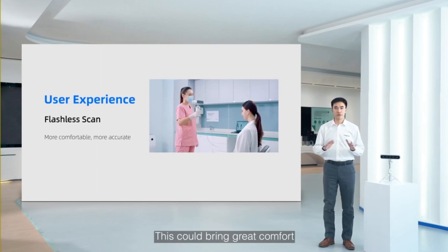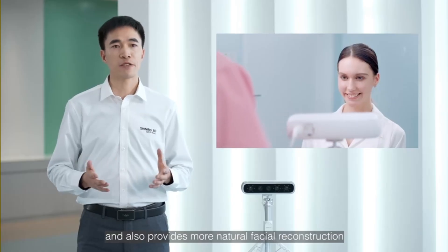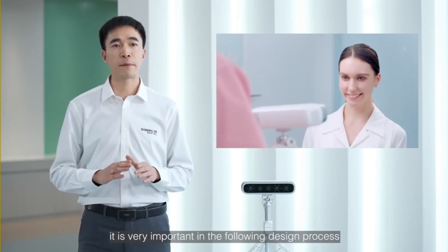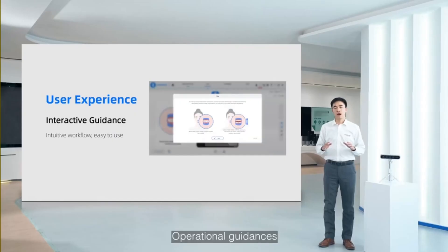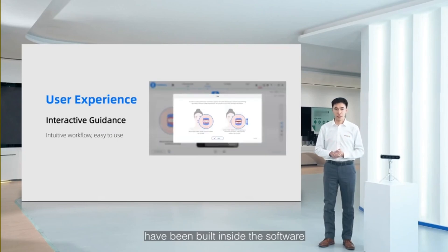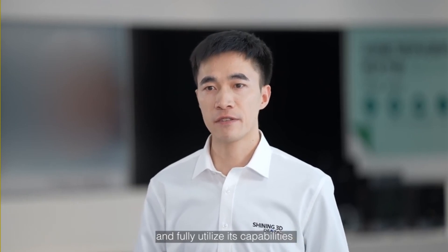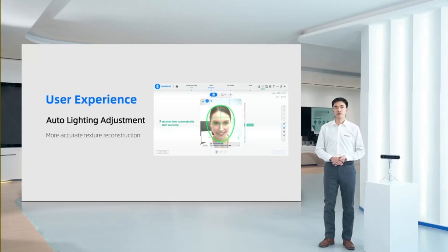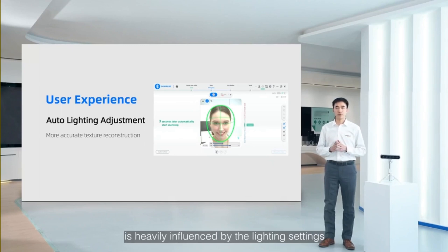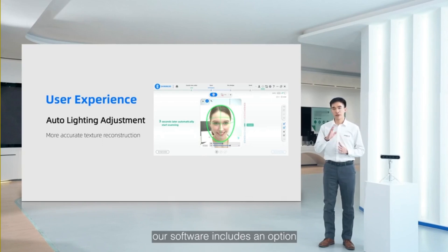It adopts eye-friendly infrared light which is imperceptible to patients during the scan process. This brings great comfort and a smooth scan experience, and also provides more natural facial reconstruction, which is very important in the following design process. Operational guidance throughout the scan workflow has been built inside the software, so you could reduce the learning curve to the maximum and fully utilize its capabilities.